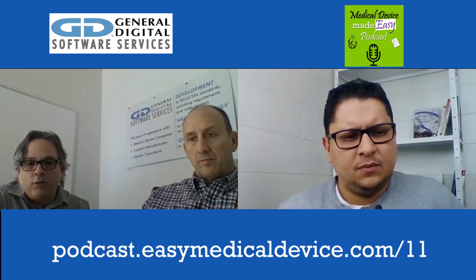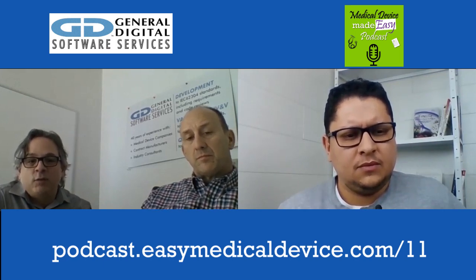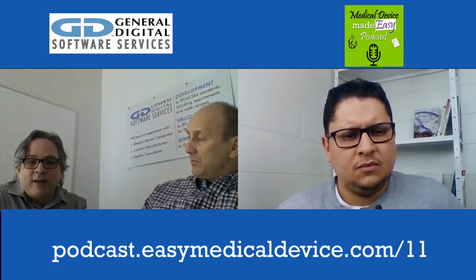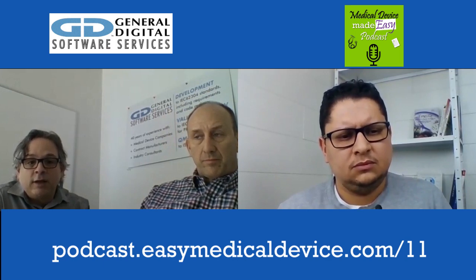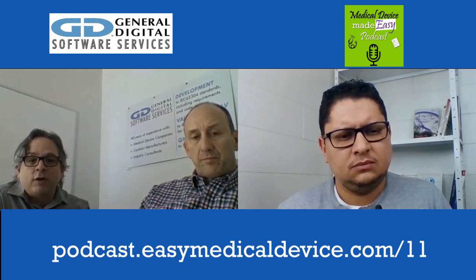Okay. So you don't exhaustively test that particular tool or software that you're using. But again, that's where risk comes in. Even if it's financial risk or safety risk, you want to make sure that it's doing what it's intended to do, and whatever test cases you need to prove that is all you need for those kinds of things. It's mostly the critical stuff, mostly software that lives inside the device and is going to control anything where somebody can get seriously injured or possibly die. You want to make sure that you treat that as a safety critical component.